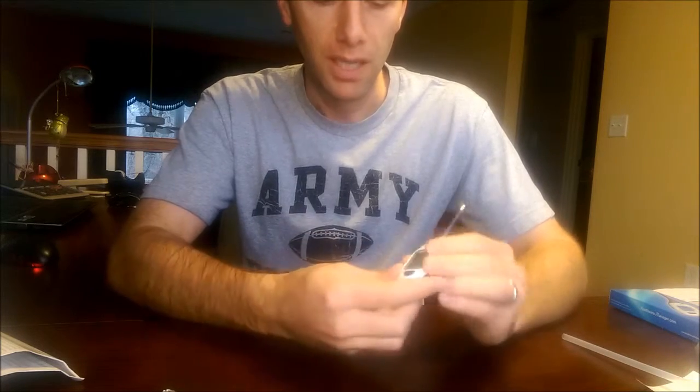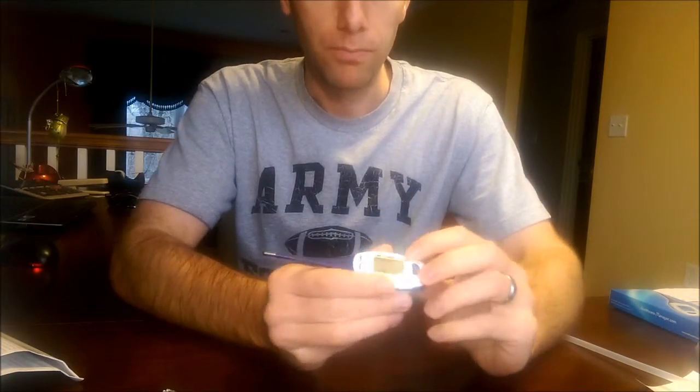It turns off after 10 minutes, or you can hit the button. It has a quick chart that shows you if a temperature is normal, a little high or low, or really high. So with that, I'll show you how it works.